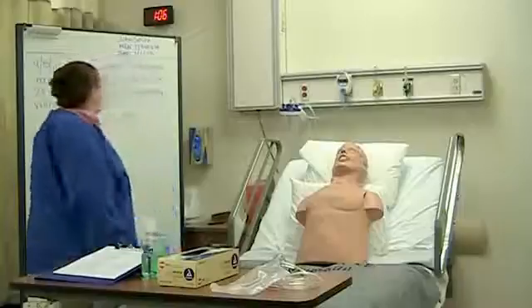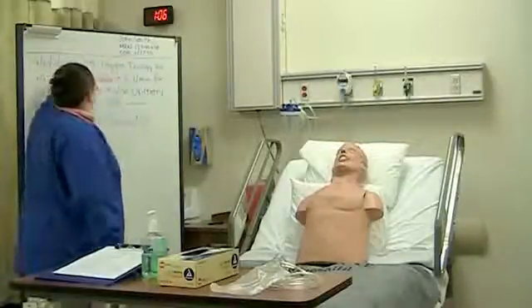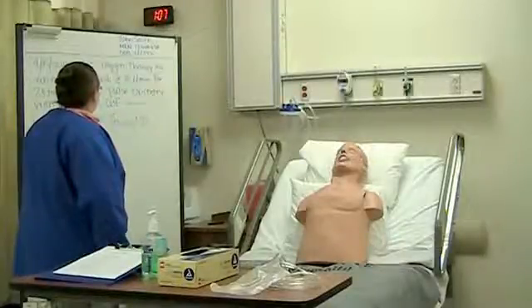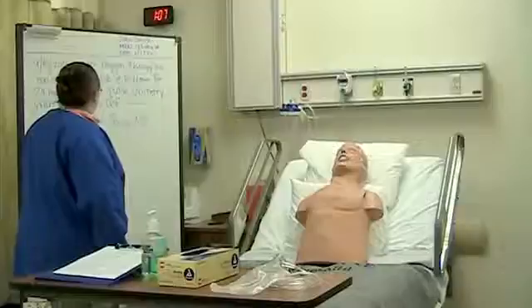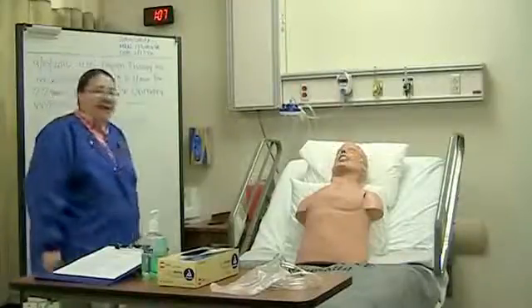The first thing I will do is verify my physician's order, which you can see behind me on the board. My physician's order has the date and the time, oxygen therapy via non-rebreather mask at 15 liters per minute for 24 hours. Document pulse oximetry with vital signs Q4, and this order is signed by Dr. Jones. At this point in time, I'm going to take a few moments to review my patient's chart for any significant findings related to their care.